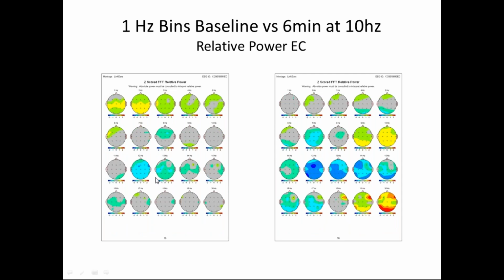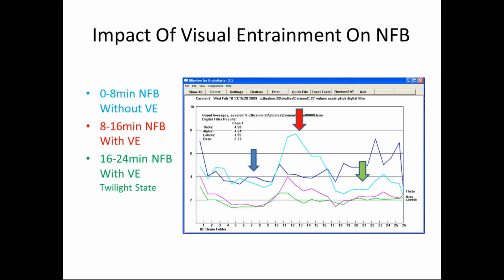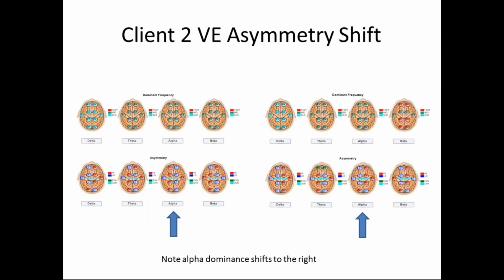You can see that pattern here. The photic's running, gets rid of low frequency. It's stimulating harmonics. In this case, we're probably using a square wave. In the workshop, I go into some of the research on how we experimented with and without photic with different people, with driving photic, like Brainmaster does and so forth.